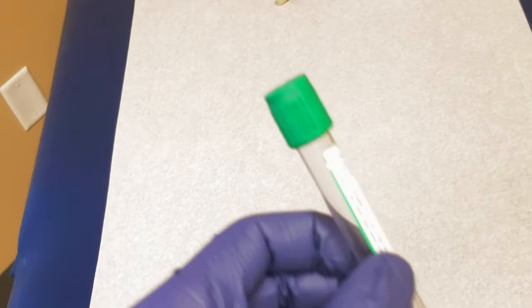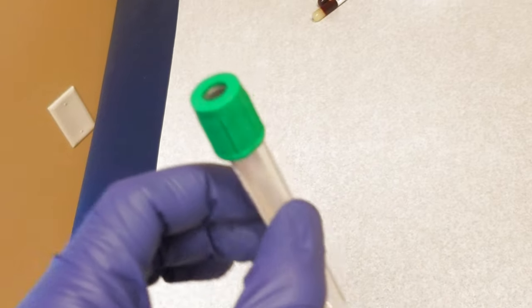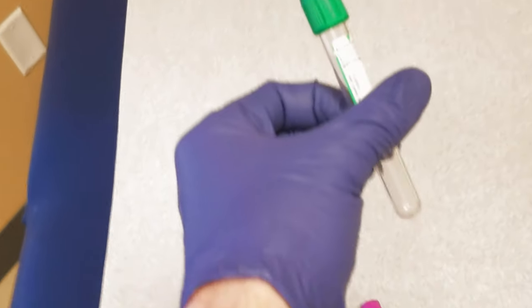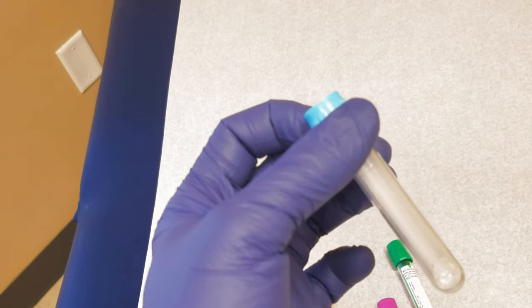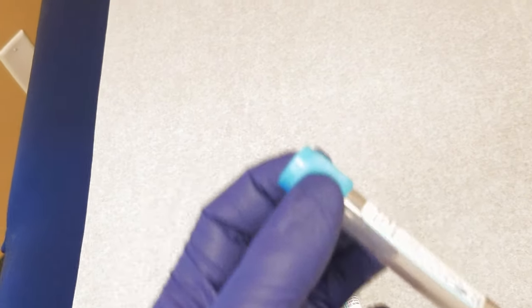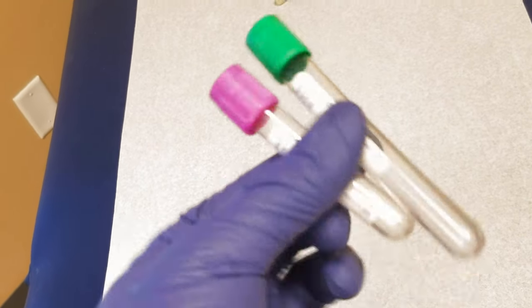This is a heparin-containing tube used for some other whole blood tests, like certain genetic tests. You draw the blood and the heparin prevents clotting instead of EDTA. Lastly, there's the blue top tube — the light blue top — used specifically for clotting tests like the PTT and PT/INR to look at clotting times. With this one especially, you have to make sure you fill it up completely and mix it thoroughly. That's also important for the other two anticoagulant tubes.